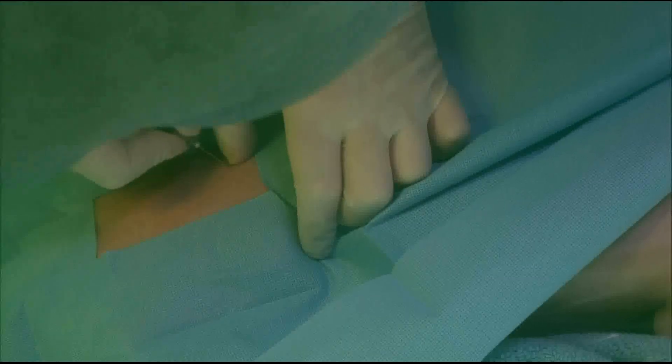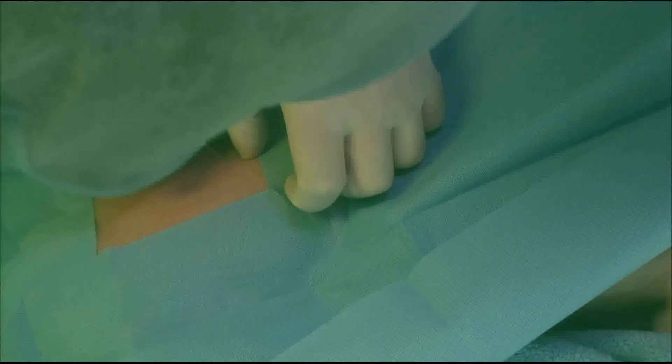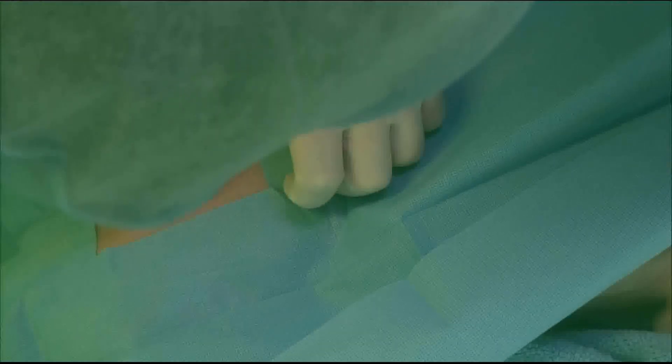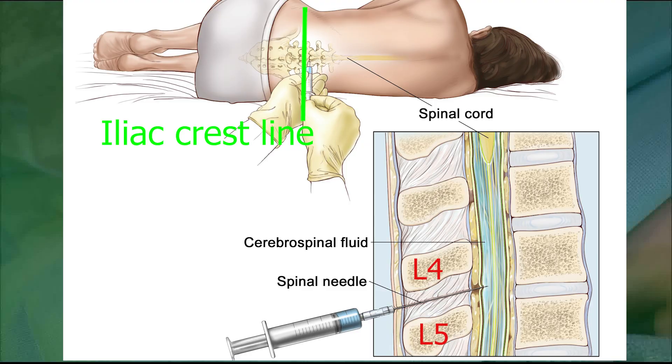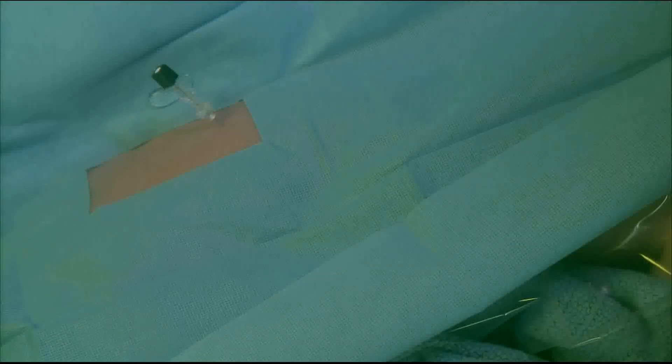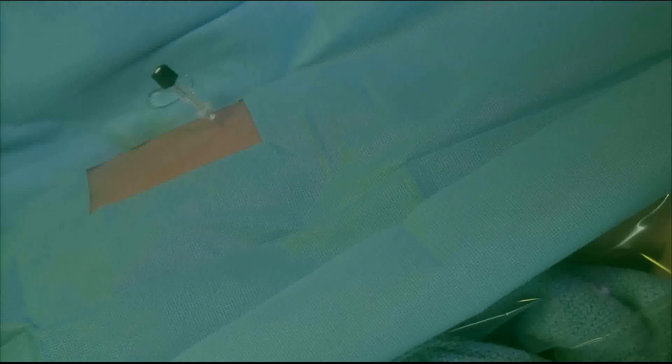Once you have identified the correct space, make sure your needle is not hitting bone and continue to advance. Make sure the stylet is inside the needle, and once you feel that the soft tissues have given way, remove the stylet and check for CSF backflow. You can clearly see the CSF backflow here, which means you have successfully entered the intrathecal space and are ready to inject your intrathecal baclofen.